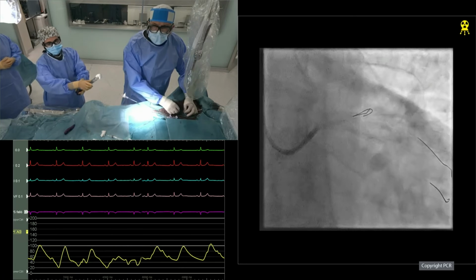But I guess the colleague wanted also to know about, at this stage, with a stent towards the circ, does it make sense to do DEB as a balloon strategy towards the LAD, left main LAD? Absolutely. I think if you balloon the LAD, then probably you should also consider DCB in the LAD. Yeah.